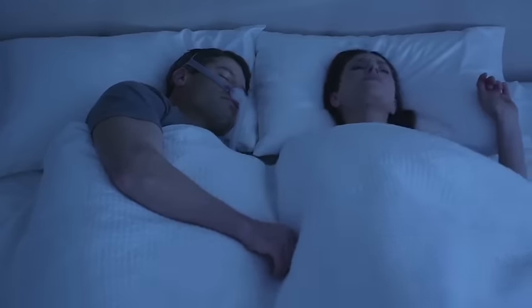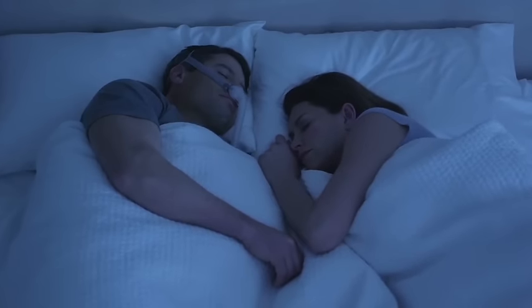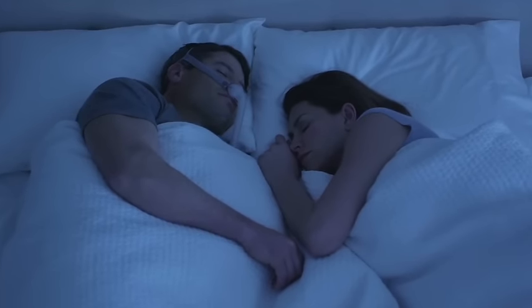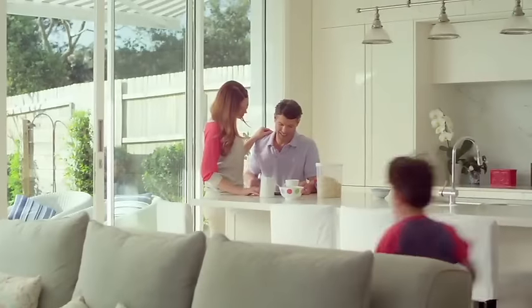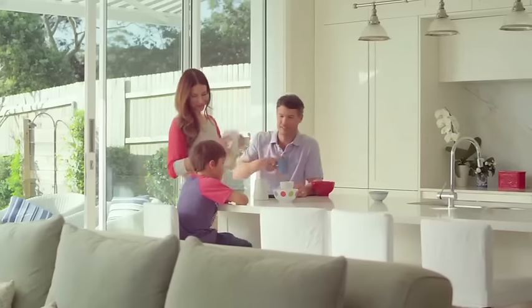ResMed's AirFit P10 nasal pillows mask with advanced quiet air venting is a quieter mask to fit your sleep. Life starts with a mask that helps give you the sleep you need to enjoy every day.